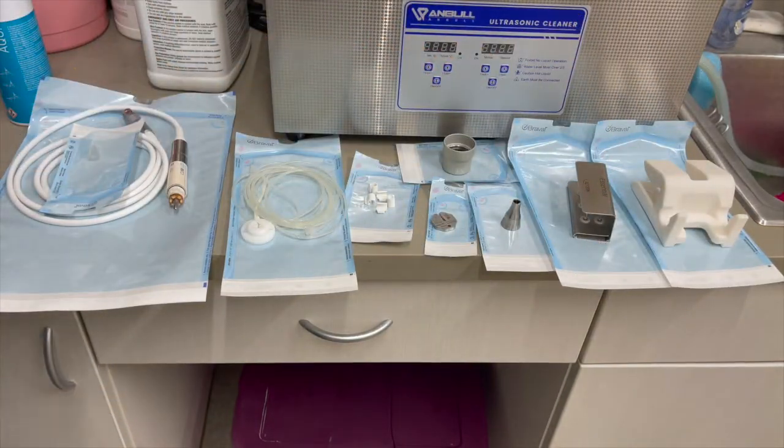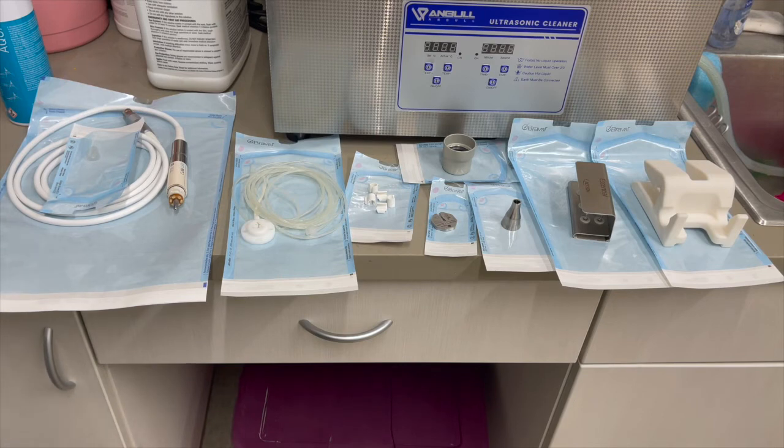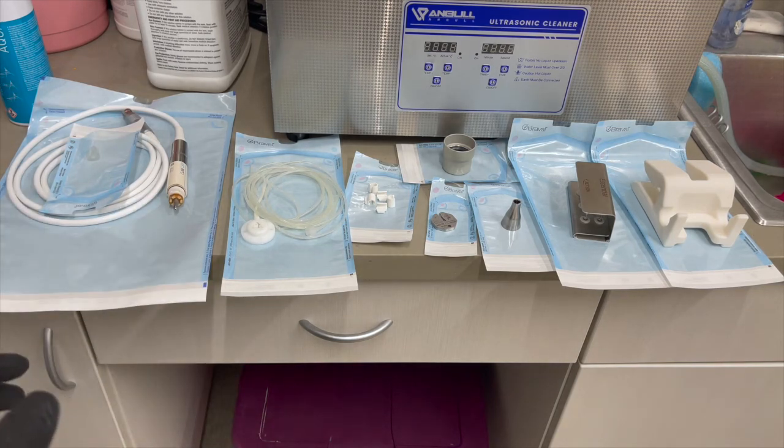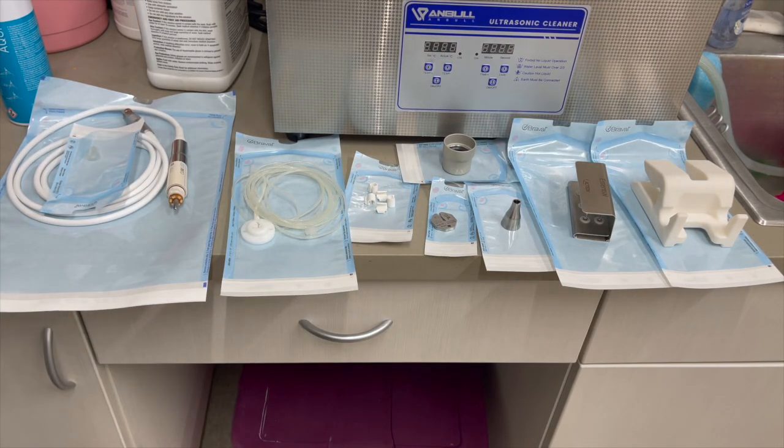Once you've bagged all of these items, they can then be put into the autoclave. There are a few different types you might come across — a vacuum autoclave like the Bravo from Scican, or a pressure pulse vacuum steam autoclave such as the M11. Both would work. I would not suggest putting any of these items into a dry heat autoclave — these are meant to go into a steam autoclave or a vacuum autoclave, but not dry heat. Once everything has been autoclaved, you're ready to use them.